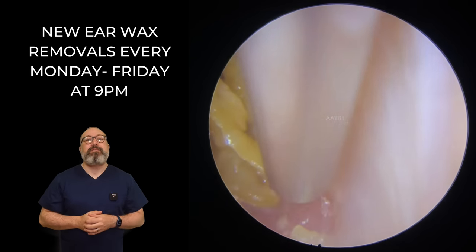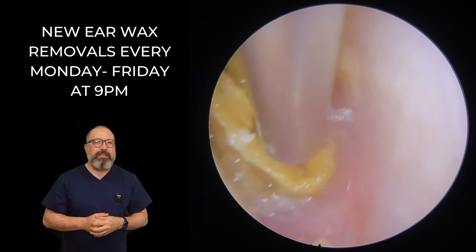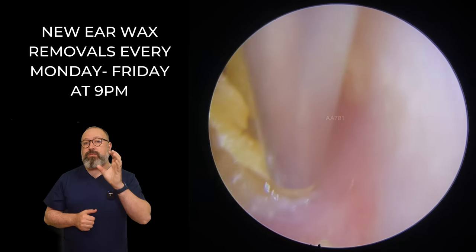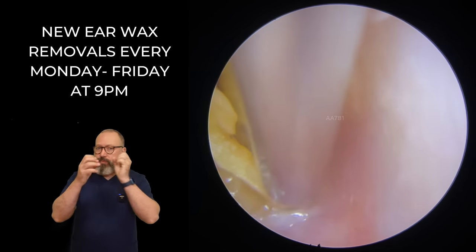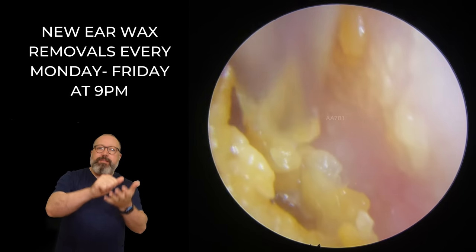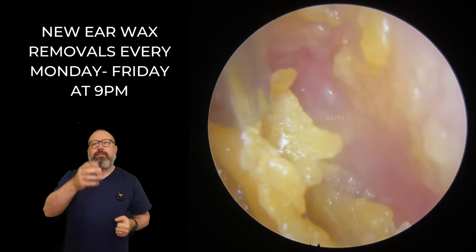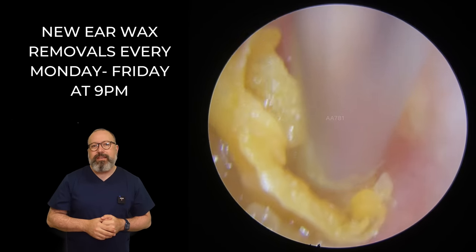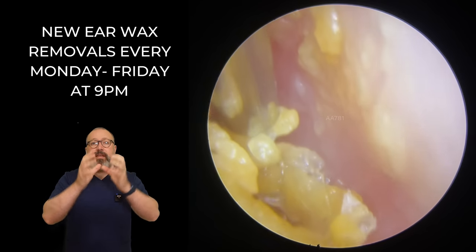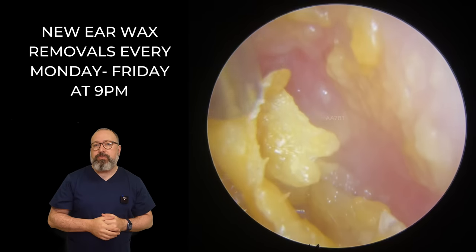Second patient in the compilation — very different. Now this is mostly skin. This is that epithelial layer coming away here. Very light in colour. You can see it's very hard and brittle as well. This is skin that's really hardened up. Remember we talked about that keratin — that protein inside the epithelial cells — and when it starts to harden up, it's just that basically the protein inside starts to harden everything up. And that's what's happening here. We can see it's quite deep, almost folded away like a little sleeve, and it's collapsed down and hardened up in that position. It's very, very close to the eardrum, this one.